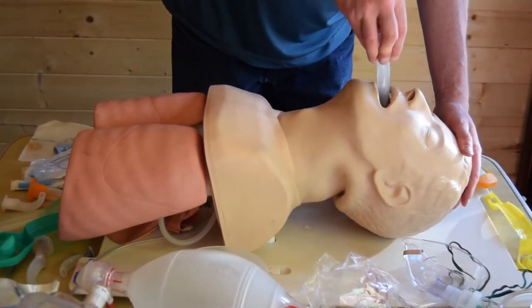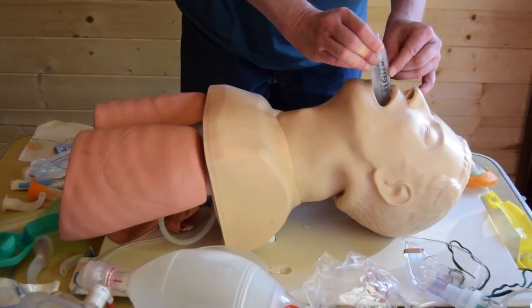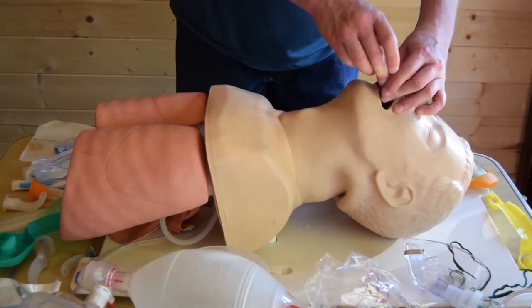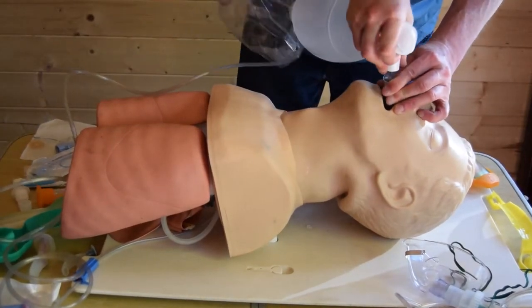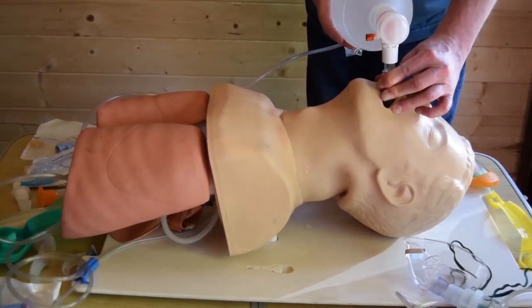There we go, it's much better. If you can see, there's a red line on this airway, and that should come to rest at the teeth. So if I attach this now to a bag valve and mask, and if I squeeze that, you can see the lungs inflate, and we know we have a good airway.